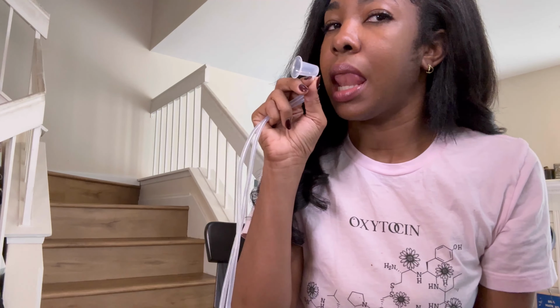And as this says, it is safe for use during pregnancy. You always want to check with your midwife or your OBGYN to ask them if this is safe for you to use. Nipple stimulation, especially more aggressive or proactive nipple stimulation, can increase your chances of preterm labor if you are at risk for preterm labor. So you do want to avoid using this if you know that you are at risk for preterm labor, or if you're not sure if you're at risk for preterm labor. It can and will cause the release of oxytocin.